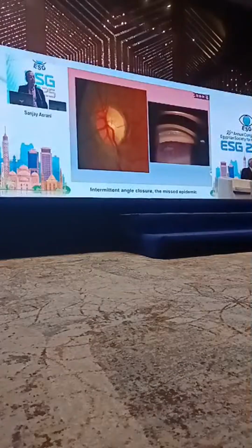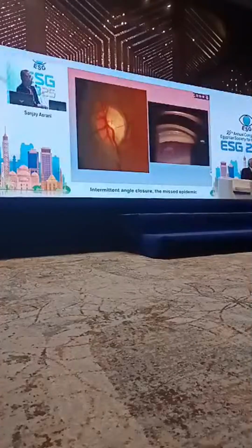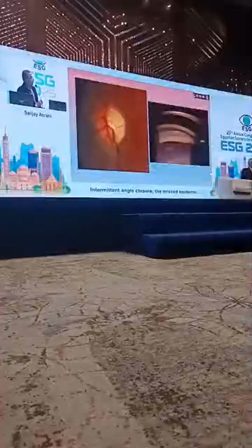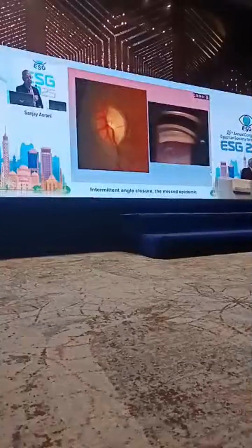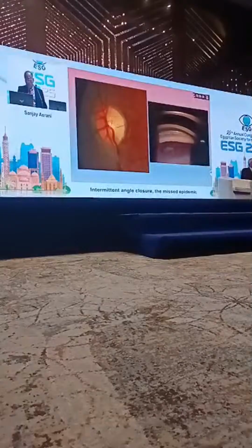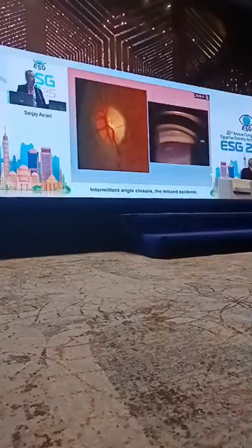The typical damage that you see of the optic nerve is a mild yellow color. You may be able to recognize there is a little yellow tint in this optic nerve. It's a mild pallor. This is indicative that this eye has had a large pressure spike. It is an ischemic damage to the capillaries in the optic nerve head. So this is a classic finding in chronic angle closure glaucomas. They may not give you a history of the same, but once you see this, you know.